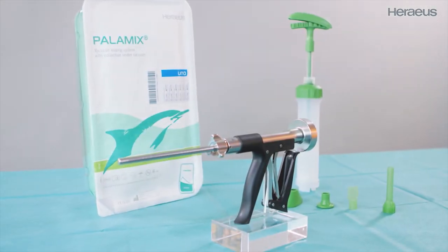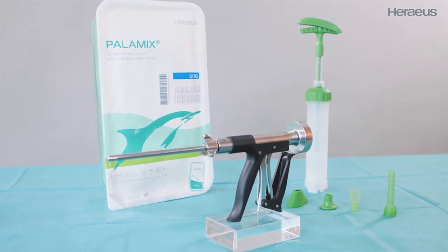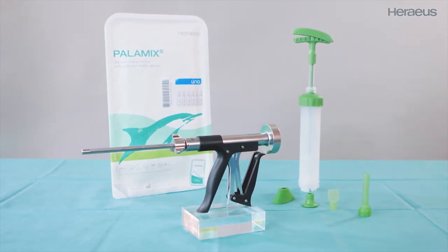Mixing and collecting under vacuum with PALAMIX. PALAMIX is a vacuum mixing and application system for bone cements. The intuitive design facilitates standardized mixing with reproducibly high quality.